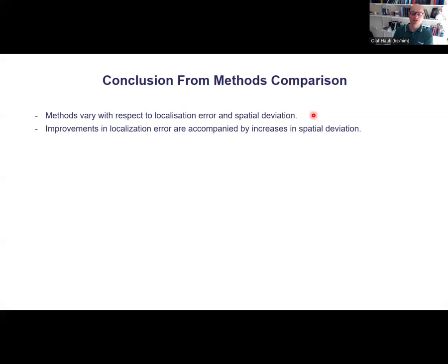So there simply cannot be any clever mathematics that gives us information that is not in the data. We can only make different types of compromises. So if you improve one thing, then something else might get worse. You know, it's a bit like a balloon. You poke one side and something on the other side will stick out, which is actually not what happens on the balloon, but anyway, I like it.